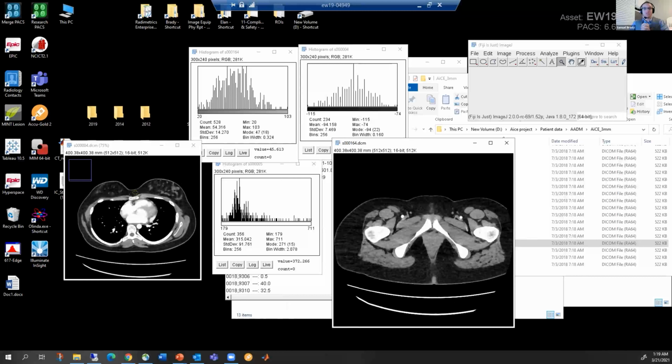Which filter do they use? They use the large filter. And that's because when we do a localizer, we're using a full field of view. That's why when you see the localizer, you can see the whole patient, arms, legs, everything. It's the full 50 centimeter field of view. It'd be interesting if I went back and looked at a smaller patient, but it's always the same. I'm almost 100% certain. You could change it if you want, but it's almost always the same. So you don't have to worry about the bow tie filter when you're doing the localizer. It's automatically set to the largest.